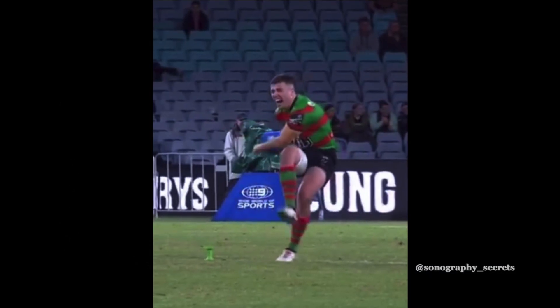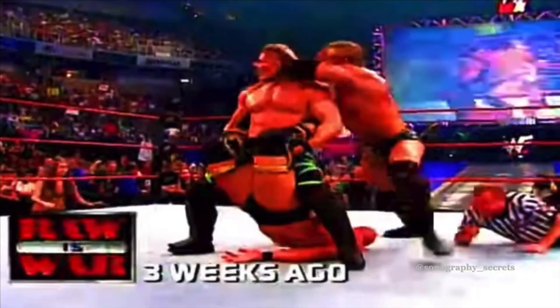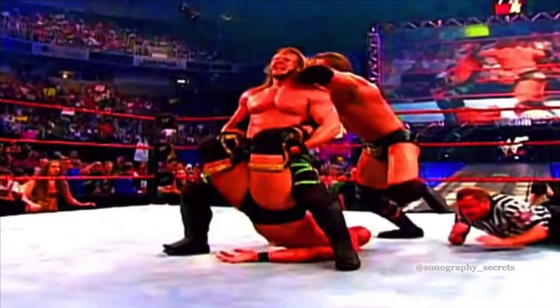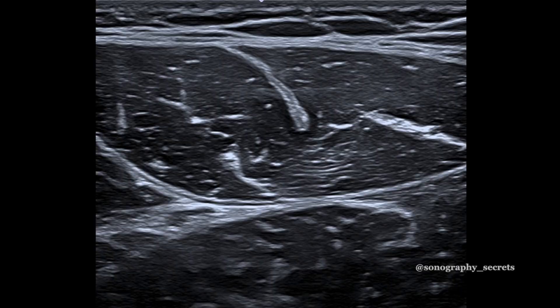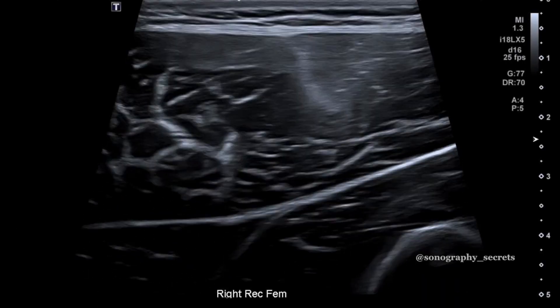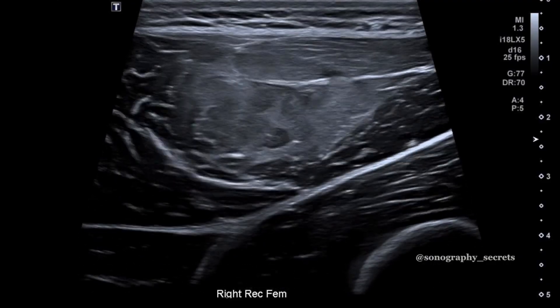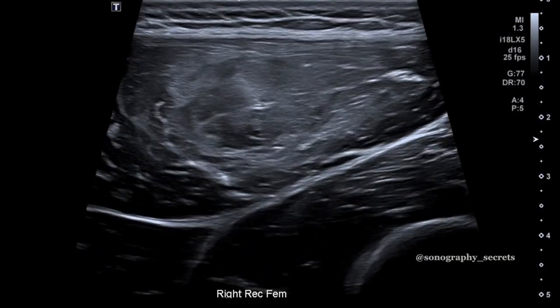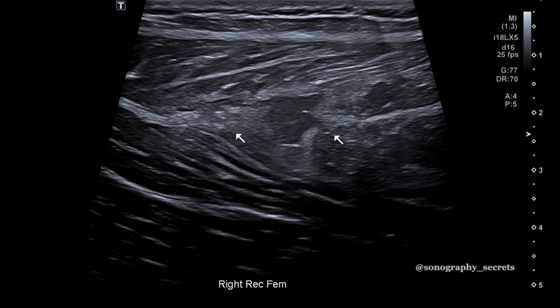Acute rectus femoris injuries will almost always be from a kicking or sprinting injury, and symptoms will vary. In many cases symptoms are relatively mild and patients will only present three to four days after the injury with prolonged and excessive soreness. The first area of assessment is the central intramuscular tendon, or the indirect component of rectus femoris, as an injury here represents the most severe or significant injury and has the longest return to play time. Here is an injury post kicking and we can see a discontiguous central tendon, consistent with a high grade proximal MTJ tear of the indirect component of rectus femoris with a complete tear of that central tendon.